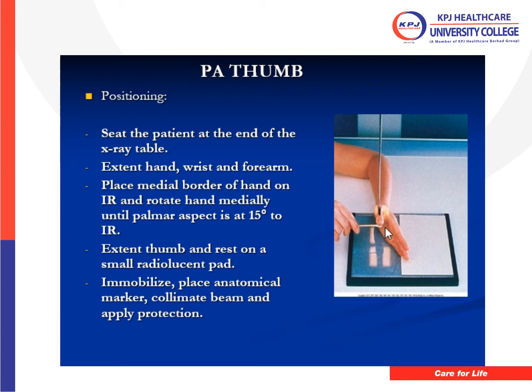We are not using the immobilization aids we saw just now, but instead using a stick. The criterion for immobilization aids is that they should not be seen in the radiograph. This one is okay, it is not projected and will not appear on the radiograph.